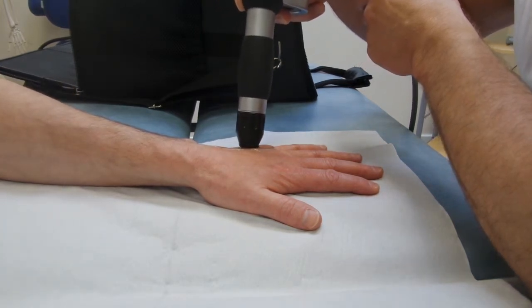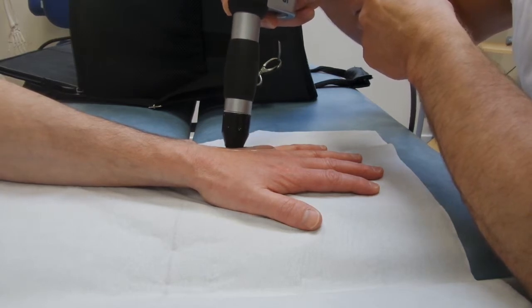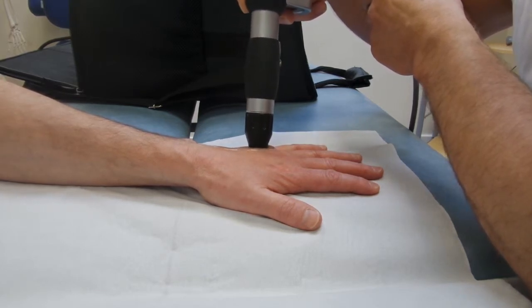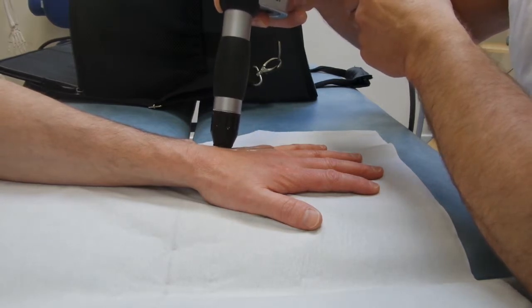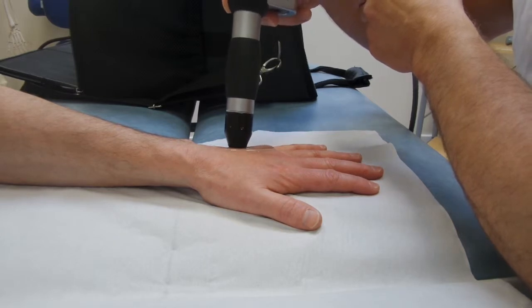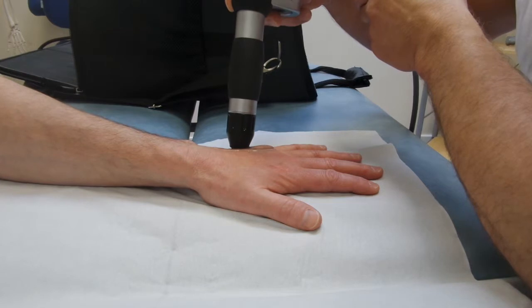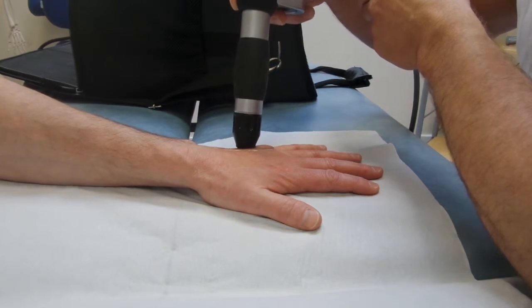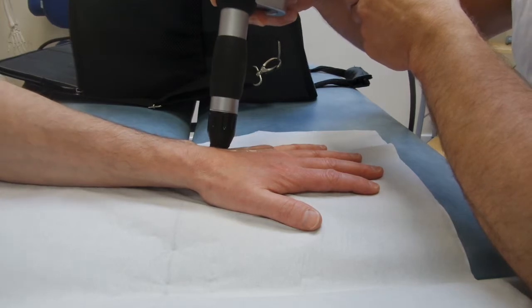As you can see the patient is giving feedback on where the worst problems are. It's difficult to concentrate on the worst areas for any length of time on the hand, simply because it's so sensitive and it really is painful to have the treatment even at these low settings when you have scar tissue in between the metacarpals.